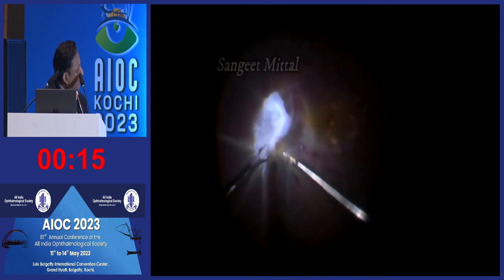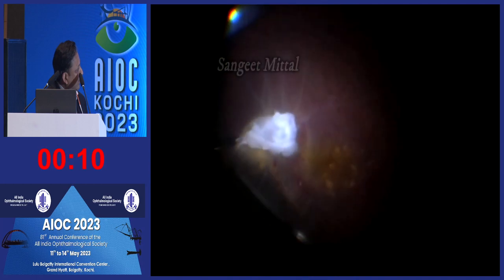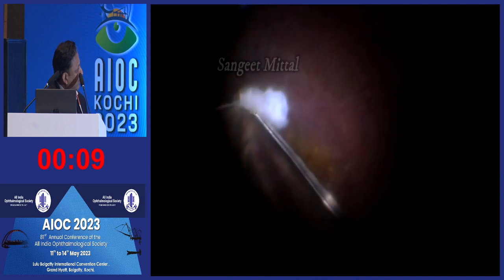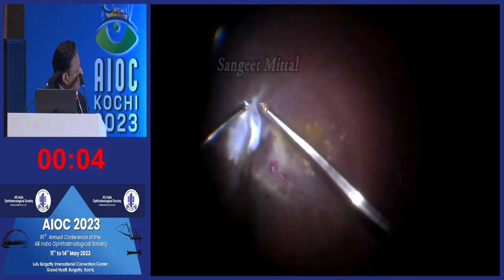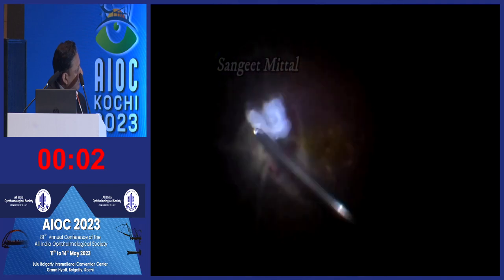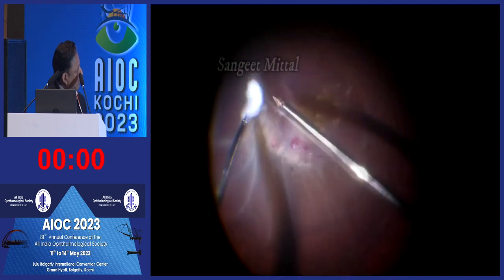Upon reaching a point where no further dissection was possible with the cutter, arrow was again used to create more openings for the cutter. Thereafter, the cutter and the arrow were used in tandem to remove the membrane without causing any damage to underlying retina. The arrow can be combined with scissors and vitrectomy cutter for efficient removal of membranes.